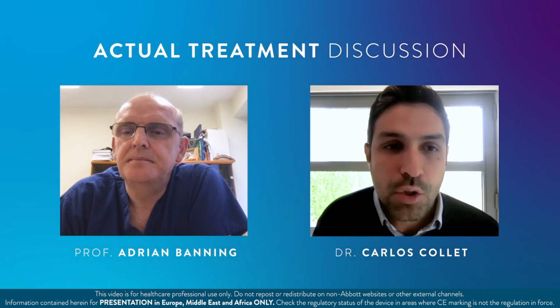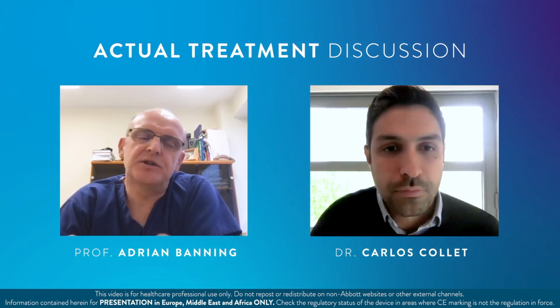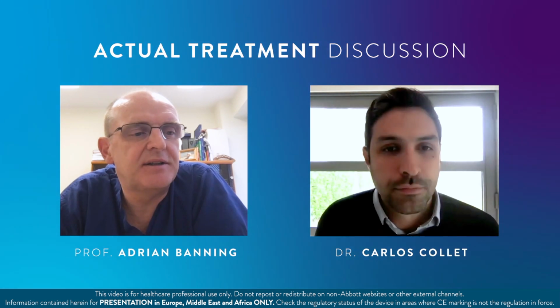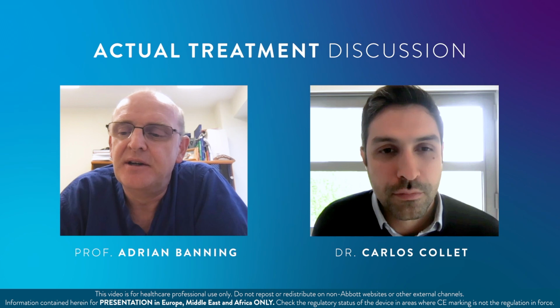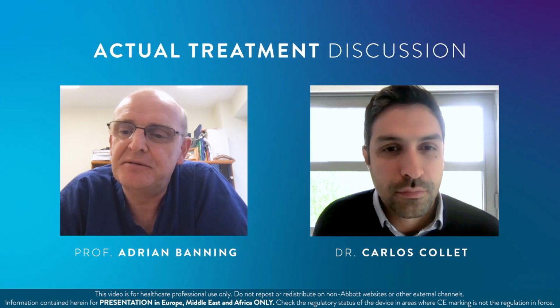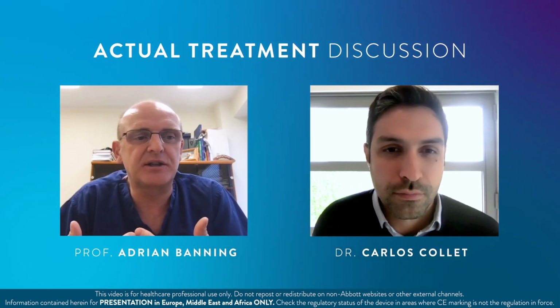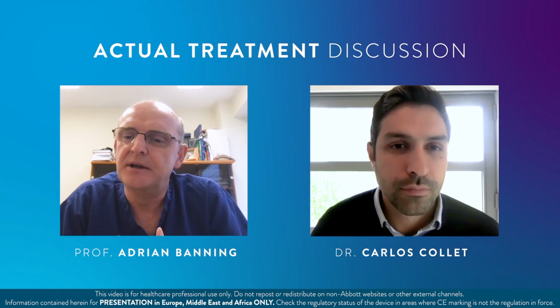So we decided to end the procedure with the OCT in the main branch. I mean, the other thing which is quite nice is that you accepted a little bit of a dissection distally on the OCT without feeling the need to put another stent in. And one of the criticisms of OCT is that we see too much and that we are kind of driven consequently to put in stents when they're not necessarily required, and that we can see small dissections, and perhaps less experienced colleagues might be tempted to put more stents in just because there's a dissection.